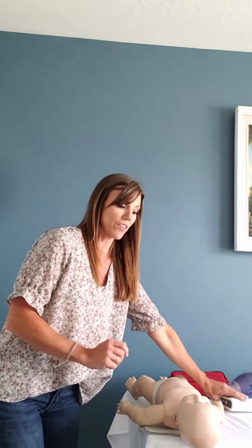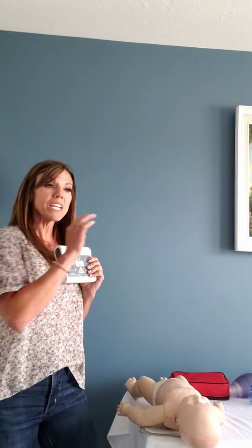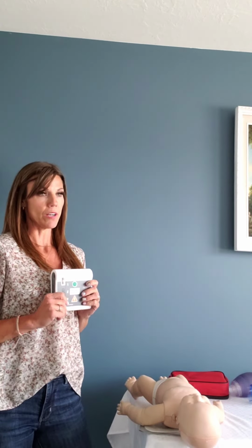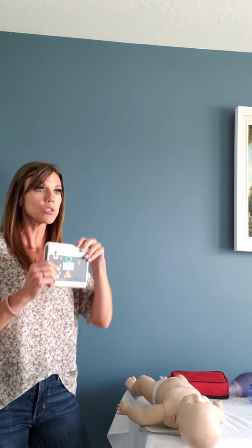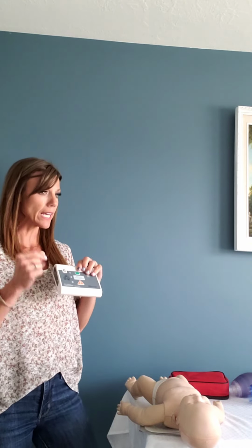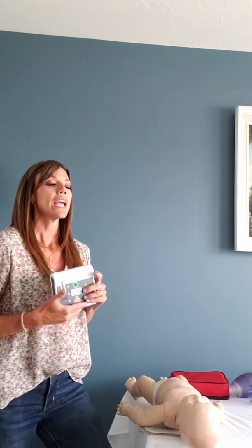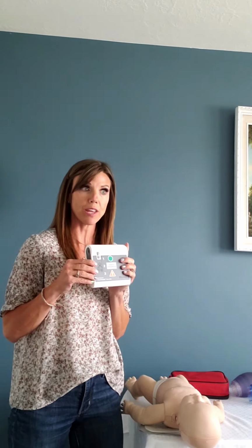But we still need to get on the chest and do our CPR like we learned in our last video and as we practiced. We need to do that good, effective CPR until our AED says it's time for a rhythm check again. So you'll still leave this on. That beeping, it will give you a little click to do your beat to. And you'll leave this on. It will count down 2 minutes and it will tell you when it's time to check that rhythm again.